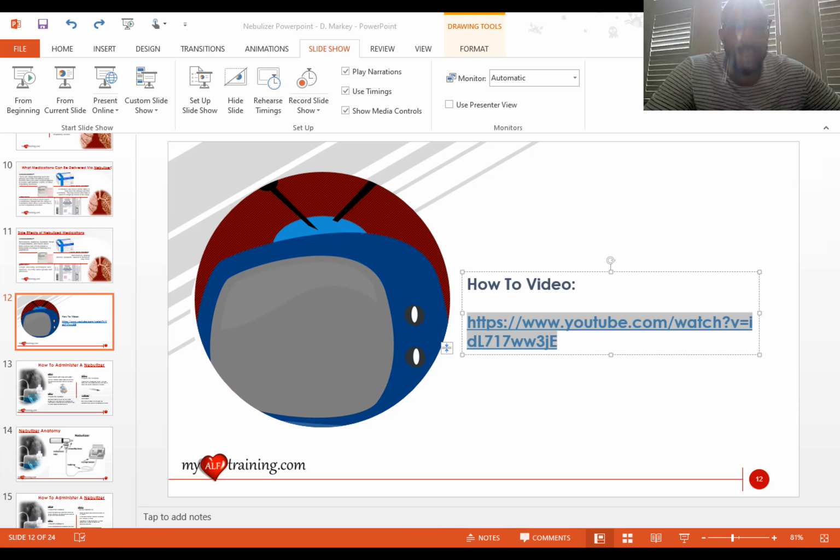So as you can see here, we have a correct way to administer a nebulizer treatment and an incorrect way. The correct way is the patient's head is more elevated, probably between 30 and 45 degrees. And therefore, the mask fitting around his face that is connected to the nebulization medication port is not flowing. It's sitting level. It's not flowing into the chamber here. But here, it is sitting more sideways. It's tilted away from the port.